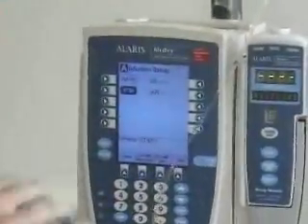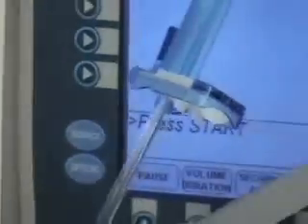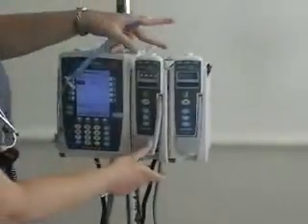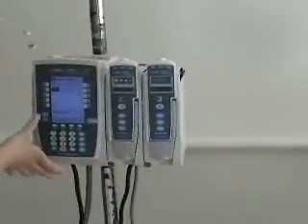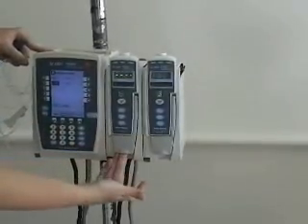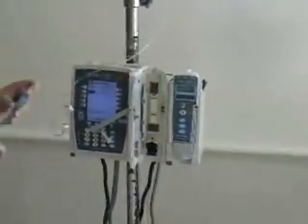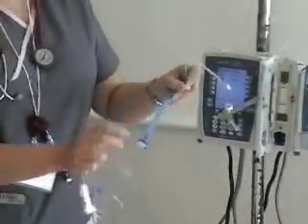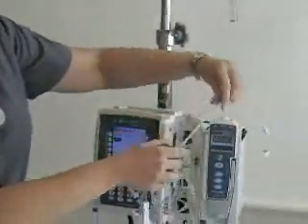Now we're going to want to start, but first we have to get our tubing in the pump. This is the silence button — that's a really good one to know where it is, especially when you're getting started. We flip this up right here and the door opens. There's a blue protective covering on this part of our tubing — we'll take this off now. It's very sensitive and bungee-like; you don't want to be playing with it. Take it off when you're ready to put it in the pump.